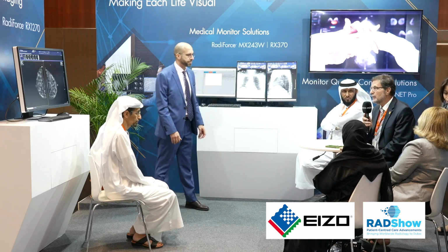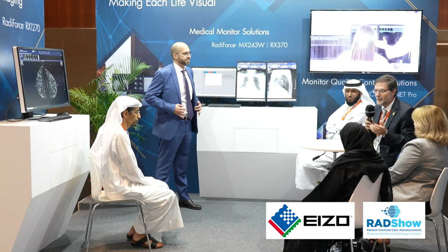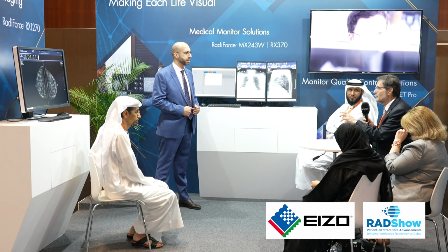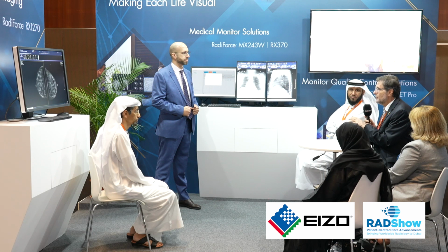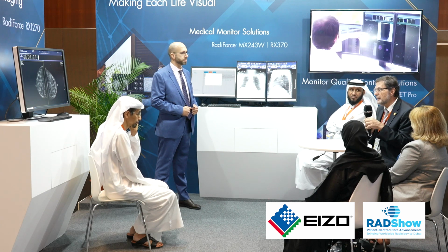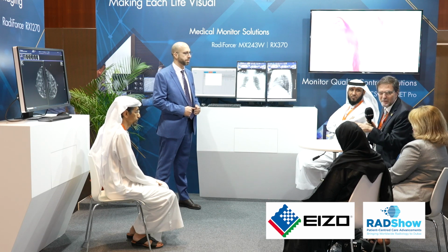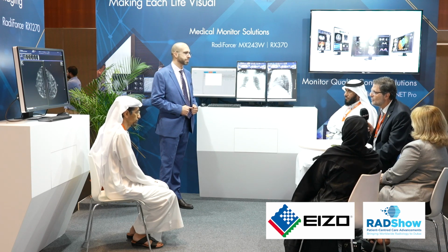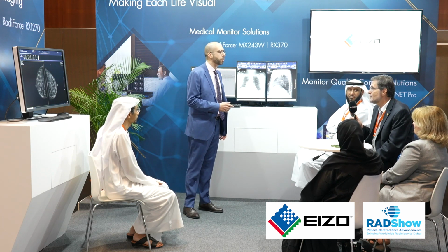Thank you for this introduction and for showing us your monitor and your achievements. Eizo is a company that is equal to quality. I mean, it's a gold standard, in my opinion, for monitors. I like the idea of the self-calibration program for the monitors. My question is how much time the program needs to calibrate a monitor, first of all. And secondly, you popped up an idea while I was hearing you. As a clinical auditor, I have to embed this calibration program into my questionnaire when auditing departments, to see if their monitors have been calibrated and to ask to see the calibration reports. That's very important to guarantee the quality of the services. So my question is how much time it needs to be calibrated?